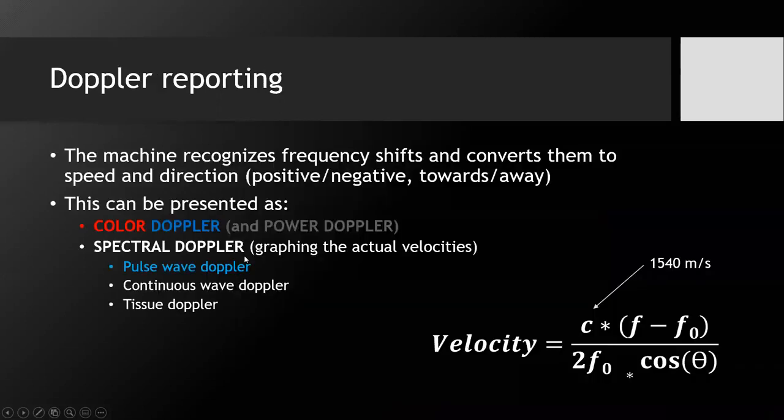I have a question with the equation. They told us that if you get multiple VTIs, you should go with the highest one, because you can easily underestimate it, and the highest number is probably the true number. That being said, here, if you're off, then your theta would shrink the cosine, and so you get a smaller denominator and therefore a higher velocity, and would overestimate it. So it seems to conflict with what they told us before. This seems like it would inflate your cardiac output if you were off axis.